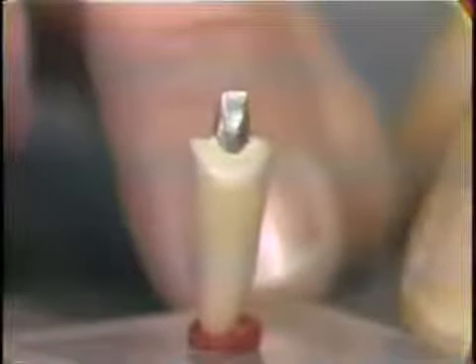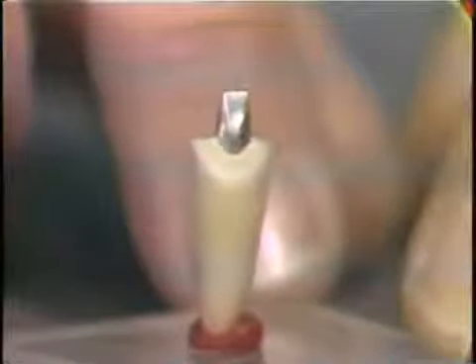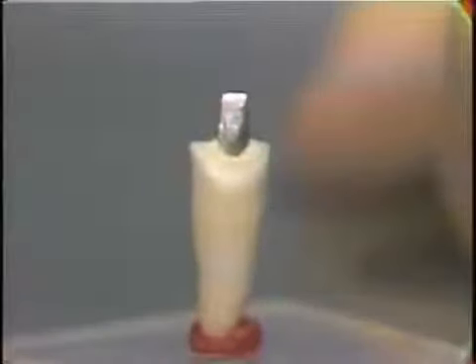You'll notice that the shoulders here are a little wider than they are in the preparation on a vital tooth. We're not concerned here with the pulp, so we can have wider shoulders and give ourselves a little more working room in the final preparation. I have another model on which I can demonstrate the actual post itself. So let's take a look at this other model here.